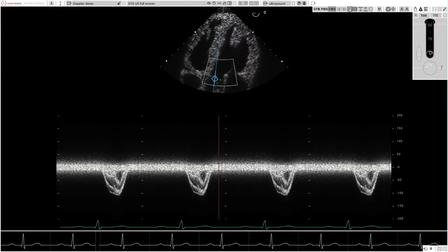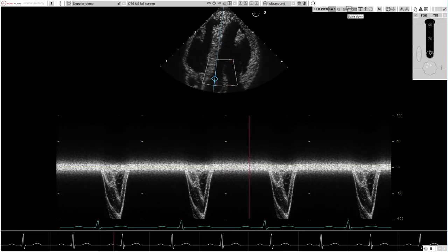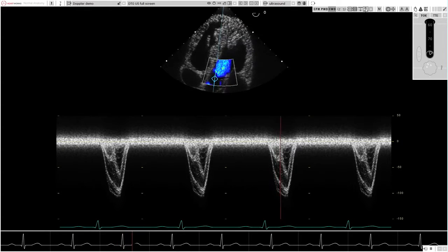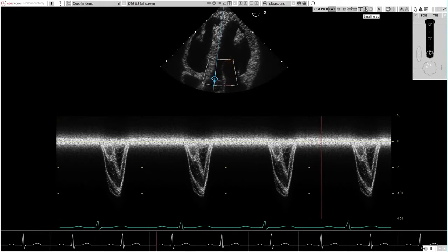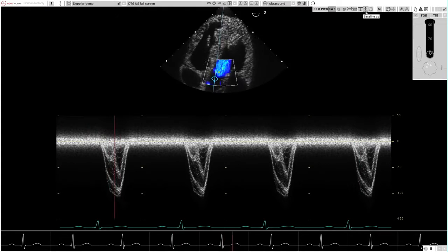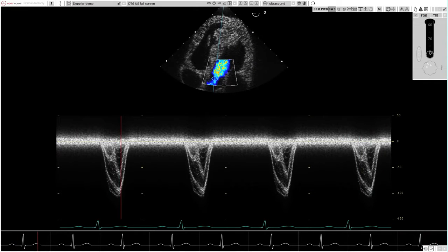Doppler assessment complements and is essential for hemodynamic assessment in any clinical echocardiography study. HeartWorks Doppler brings the student even closer to a true-to-life echocardiography study and further enhances this excellent teaching tool.